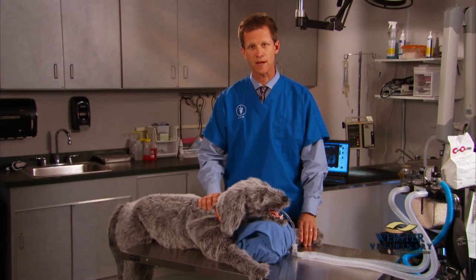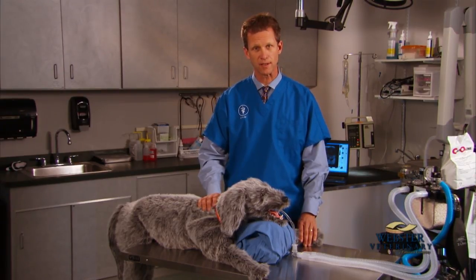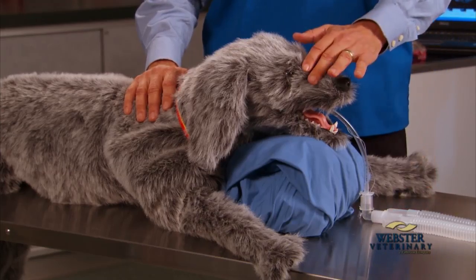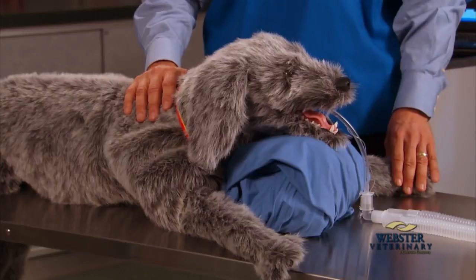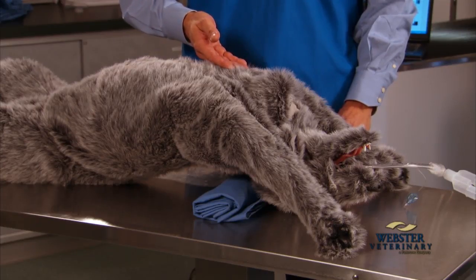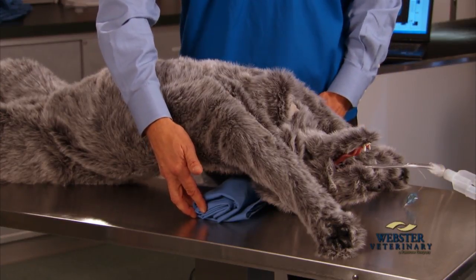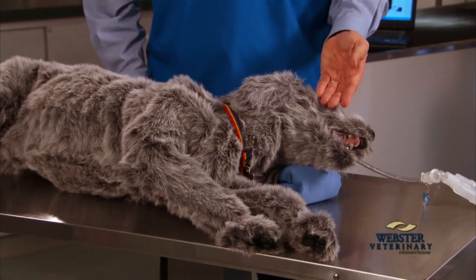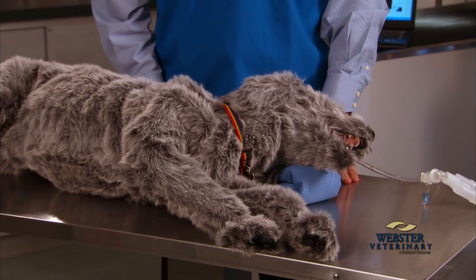When learning dental radiography techniques, consistency is important. Therefore, to reduce the variables, we like to start with all of our maxillary images with animals in sternal recumbency. For images of the rostral mandible, we prefer to place the animal in dorsal recumbency with a rolled towel placed underneath its neck to position the mandible in a parallel position with the table. When taking images of the premolars and molars of the mandible, we prefer to have the animal in a lateral recumbency with the head propped off the table. As one masters positioning, images of both the maxilla and the mandible can be taken in lateral recumbency.